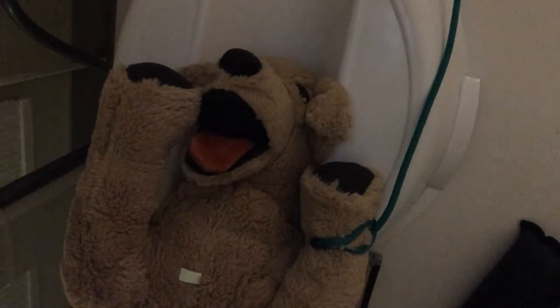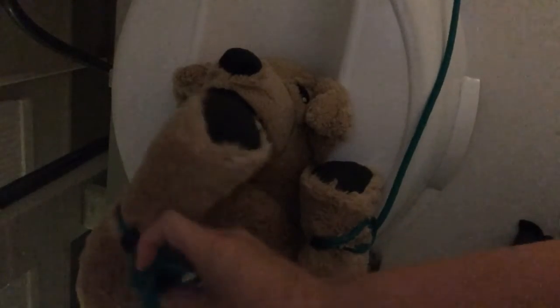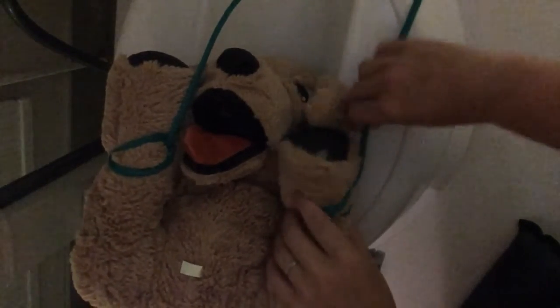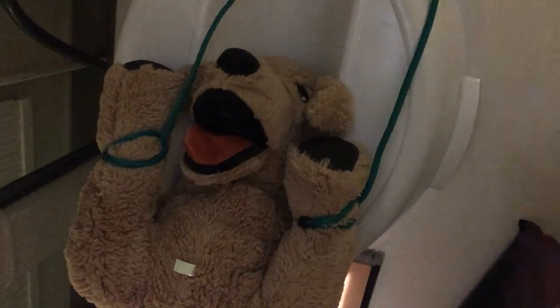I'm going to use some ties. You can use sandbags, but the reason I don't is because you will end up with the sandbags pretty much over his face, which you don't really want. It looks like you're trying to suffocate your patient, and it will knock him out. Remember the sandbags are much heavier than our patient in the exam. So you've got ties here and here, and you would put those to the edge of the table.